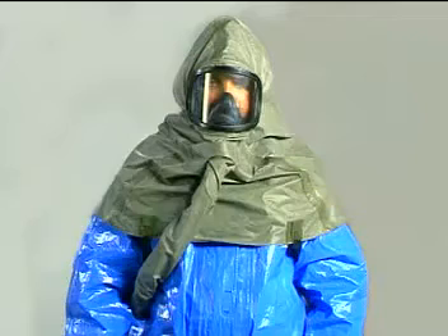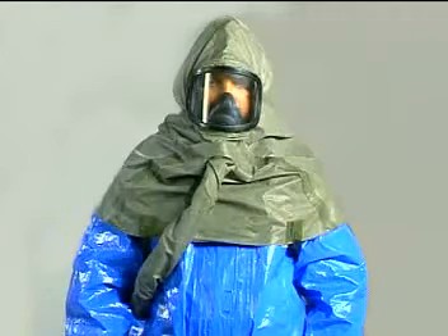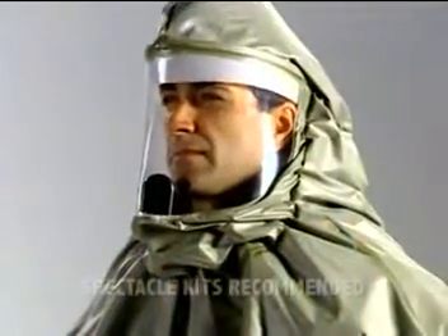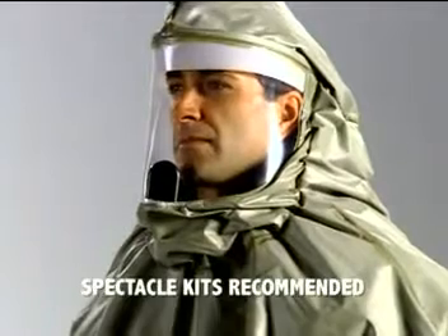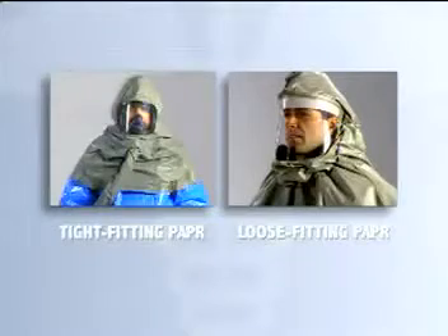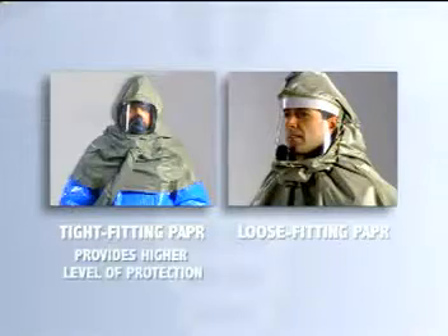The tight-fitting PAPR cannot be used with eyeglasses or facial hair because they can compromise the integrity of the seal around the facepiece. The loose-fitting PAPR accommodates both and does not require a fit test like the tight-fitting PAPR. However, the tight-fitting PAPR provides a higher level of protection than the hood type.